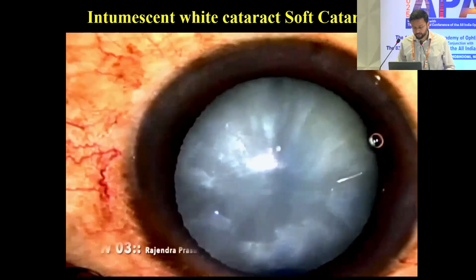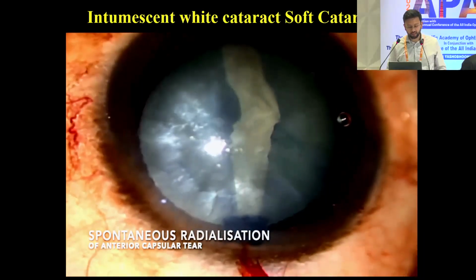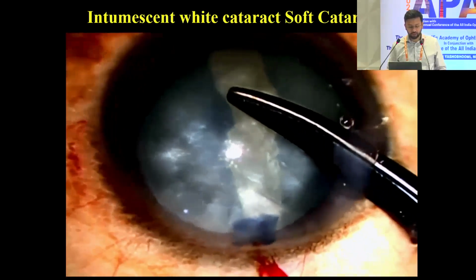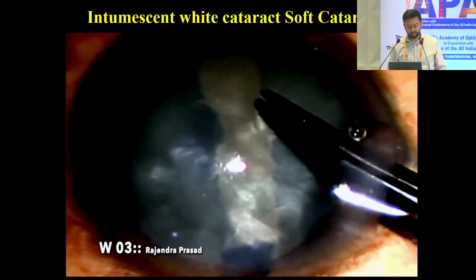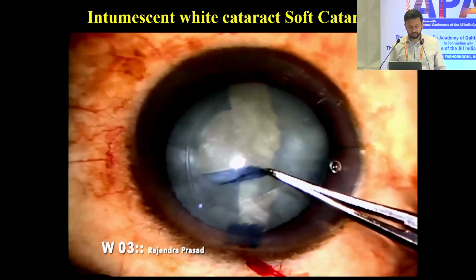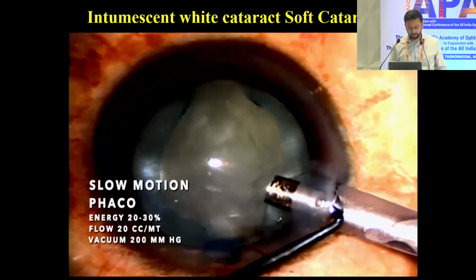So another case of an intumescent white cataract, where the Argentinian flag sign is a known complication. There is a sudden radial extension of the initial prick on the capsule. So in such cases, again, we do not need to panic. We can attempt to create a round capsulorhexis from the tear, so that during the rest of the steps of cataract surgery there is less chance of extension of the tear equatorially into the posterior capsule.